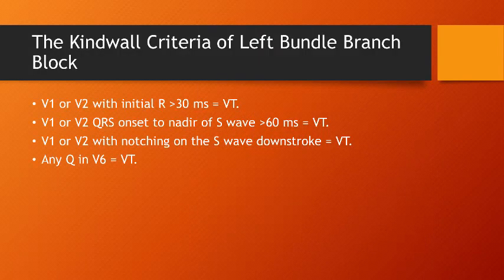Importantly, the QRS complex morphology and the ST-T waves are uniform in AVRT, as every impulse to the ventricles is conducted through the accessory pathway.